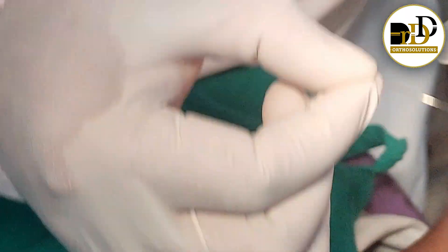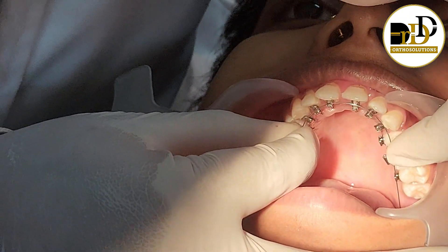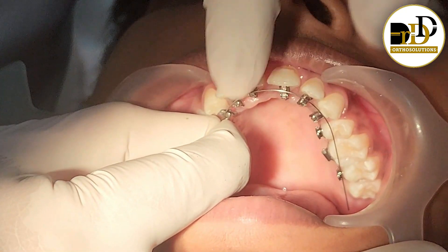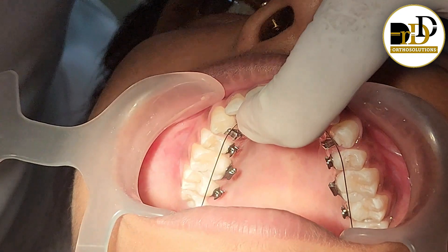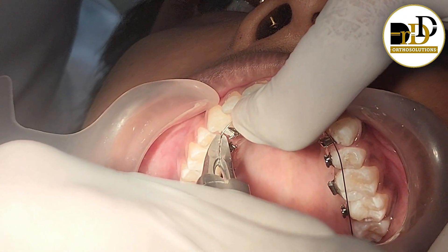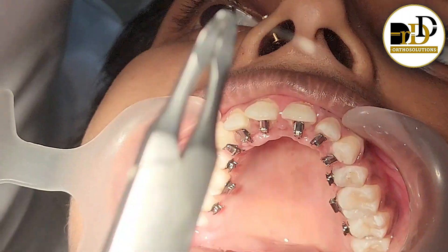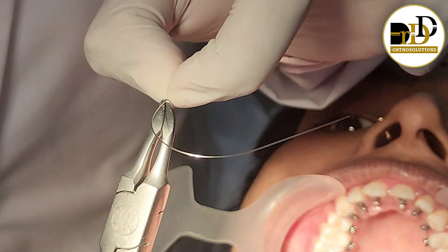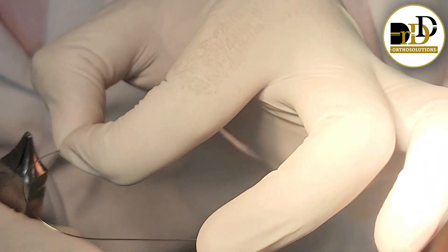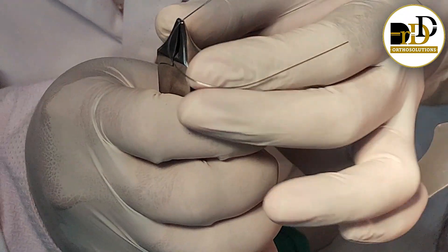Next, we are going to check the patient to decide how much bend we want to give. At the canine region, we are going to create the bend by using the bird beak plier.